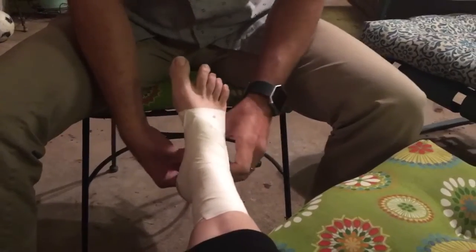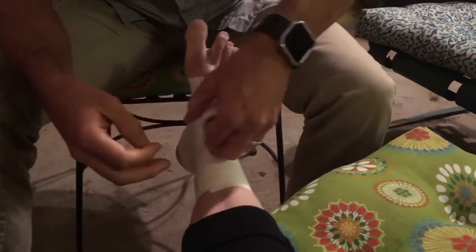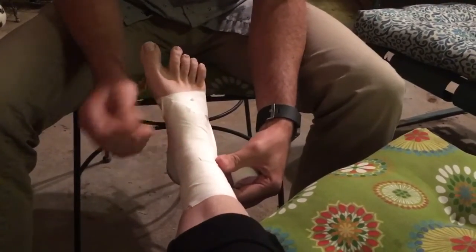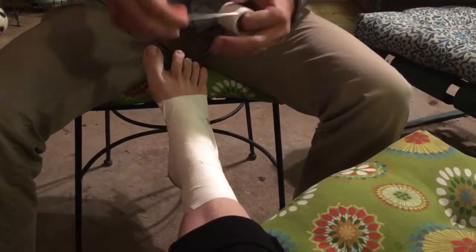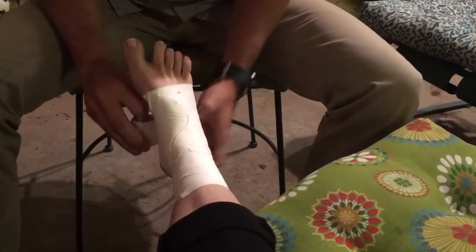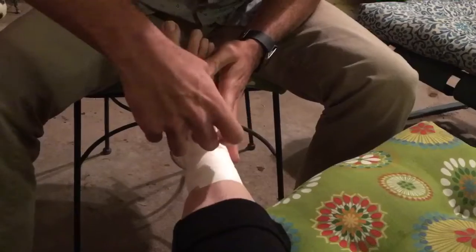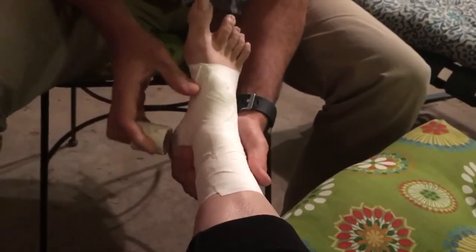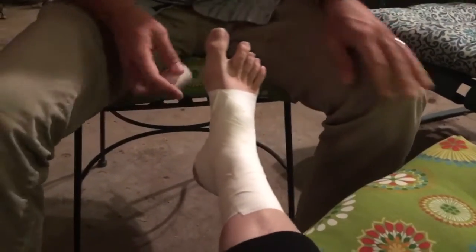We'll finish with a heel cup. That first one, we started medially, came around and finished medially. This next one will go laterally. That's it. Just smooth out any wrinkles. And you have a closed basket weave ankle tape.